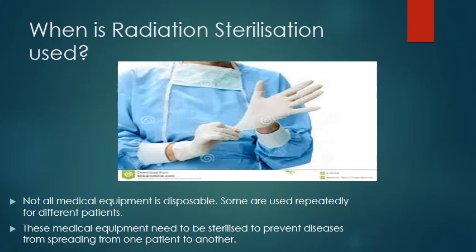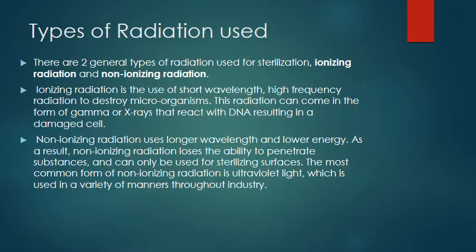Not all medical equipment is disposable. Some is used repeatedly for different patients. This medical equipment needs to be sterilized to prevent diseases from spreading from one patient to another.